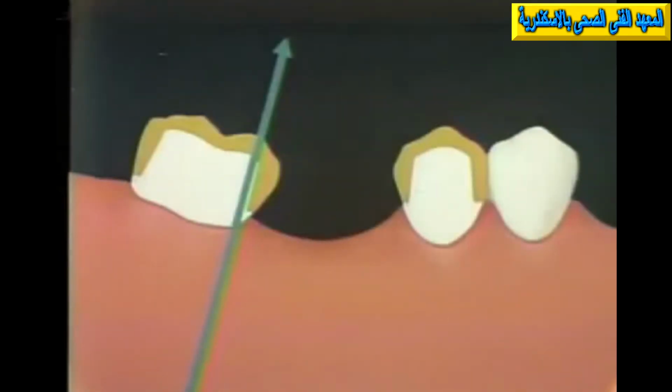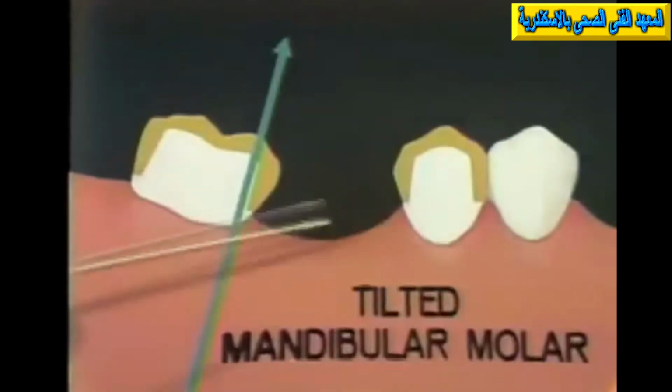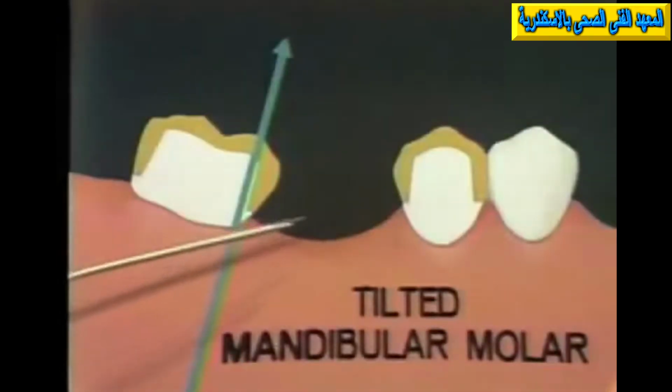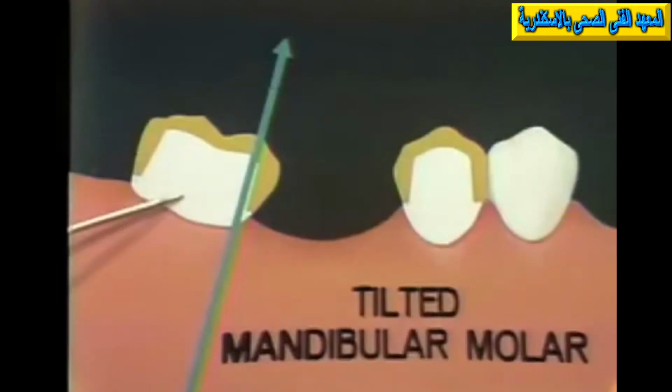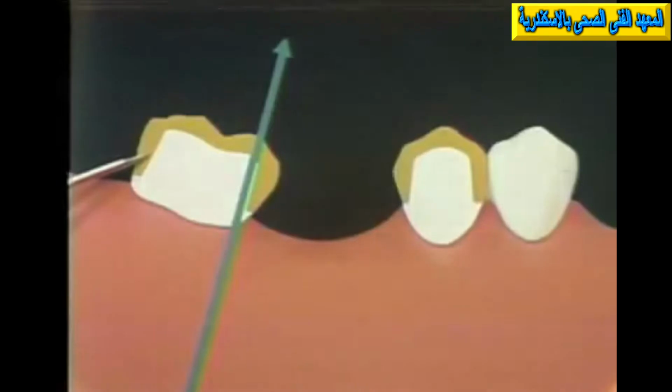The use of the semi-rigid connector to reconcile draw problems between tilted bridge abutments is illustrated in this diagram of a typical clinical case, in which, through the early loss of a mandibular first molar here, the second molar has tilted mesially. And in doing a preparation on this tooth here, and this might represent a cross-section through a complete crown or through a 3/4 crown or even through an MOD protective cusp inlay, there are limitations in the cutting of these axial walls in these 2 situations because of the relation to the pulp tissue here.